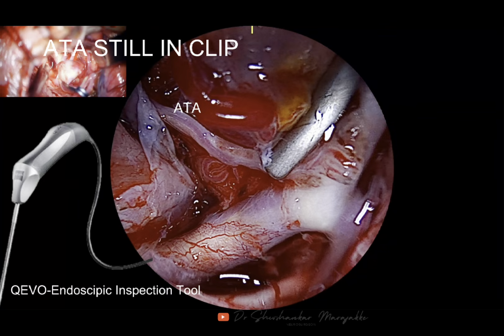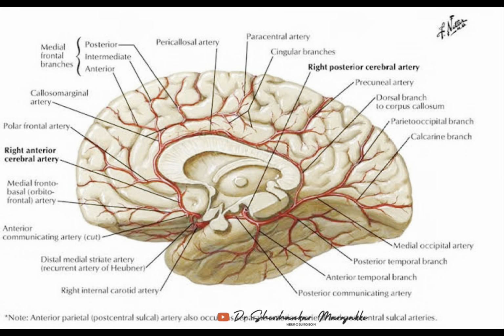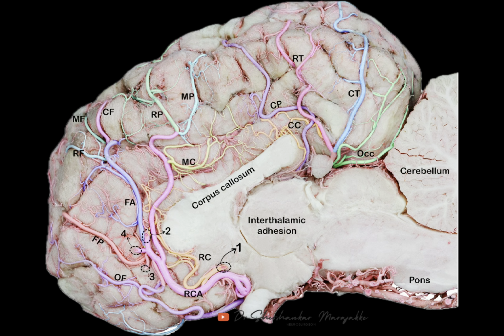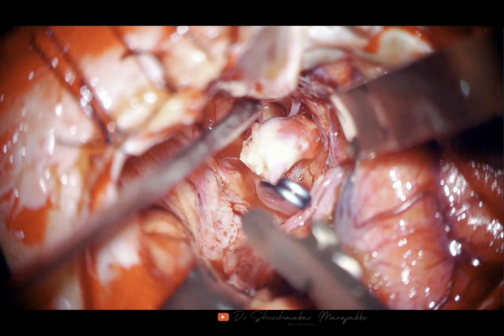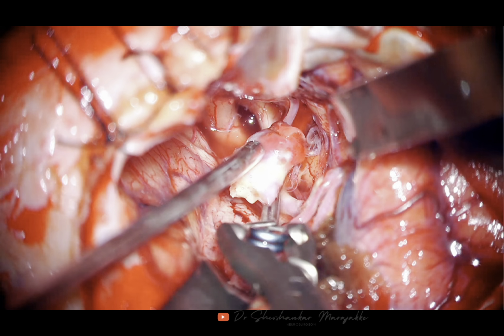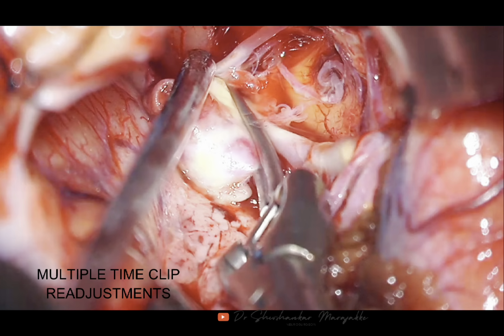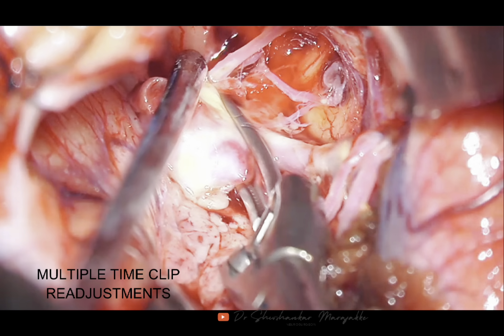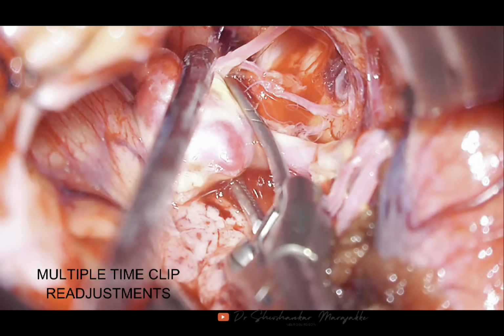So even after this, you can see that the antetemporal artery is coming into the blades of the clip. So this is what has happened. We need to know the anatomy of the antetemporal artery here. Most of the time we divide it to mobilize the temporal lobe in case of approaching the basilar artery. But in this case, I felt it is quite big and I didn't want to sacrifice it, though I'm on the right side. So I try to readjust the clip.